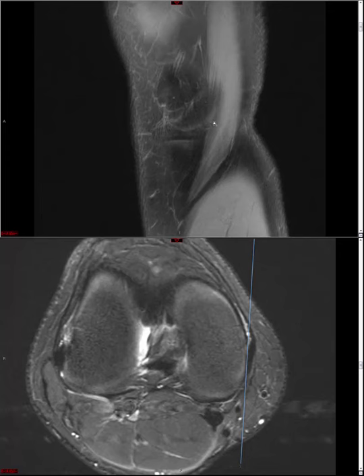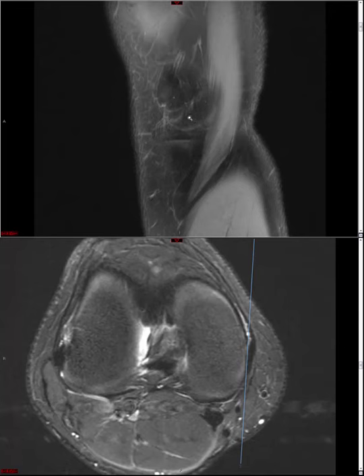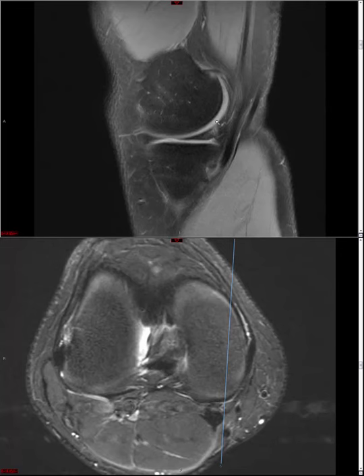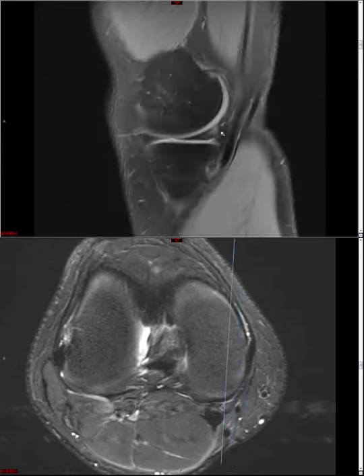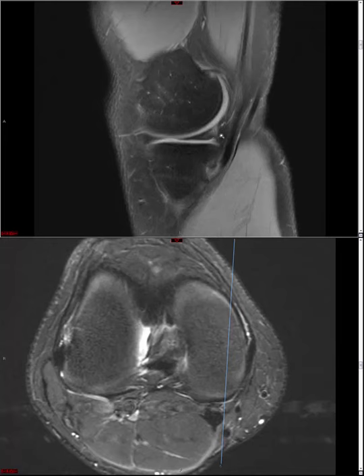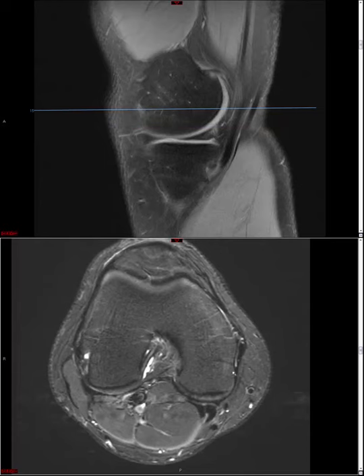When you have your knee fully extended and you apply a valgus stress, you're actually testing the posterior oblique ligament here. And when you have your knee flexed to 30 degrees and apply valgus stress, you're actually testing the superficial MCL. So this complex of structures, the posterior oblique ligament, semimembranosus attachment to the proximal tibia, and posterior meniscocapsular junction, are all components of the so-called posteromedial corner. But for now, I just want to point out the posterior oblique ligament. If you have a multi-ligament injury, then this structure often has to be assessed because it has to be addressed in the reconstruction or else the prognosis is poorer.